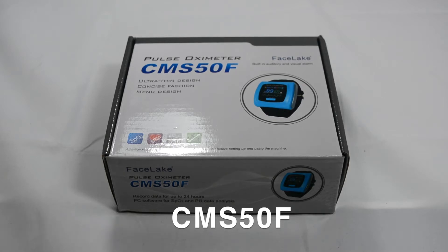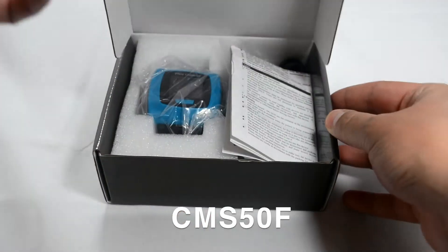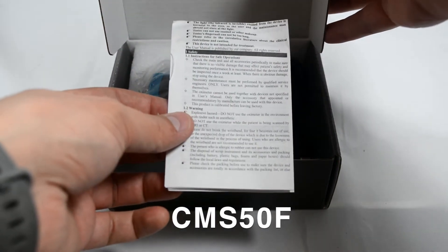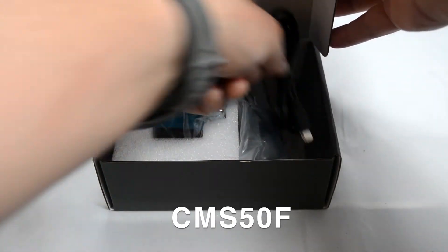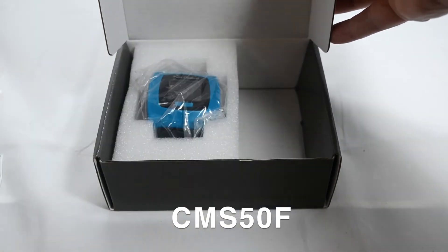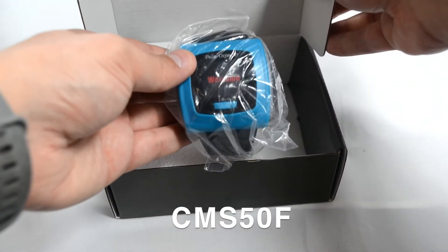Welcome to the unboxing of the CMS50F. You'll receive the user manual, the transfer cable, the finger probe, and the CMS50F device.